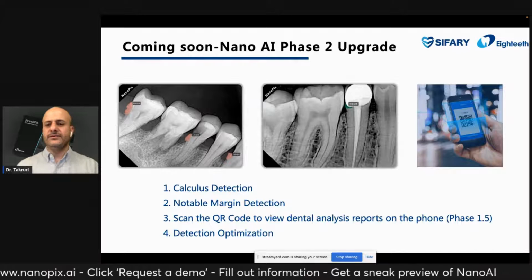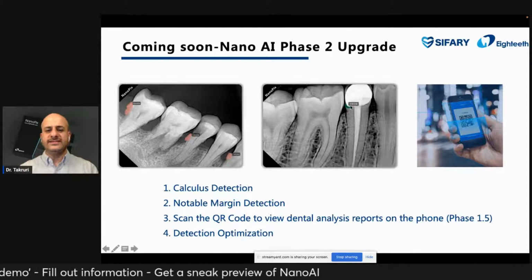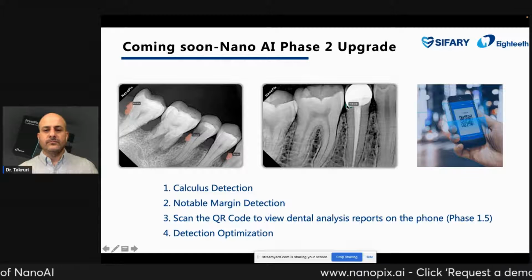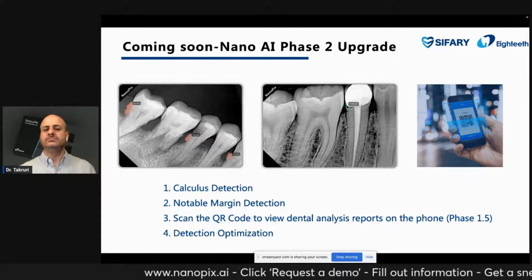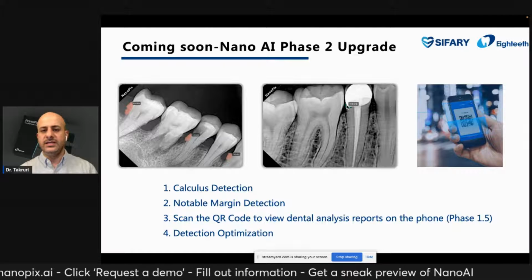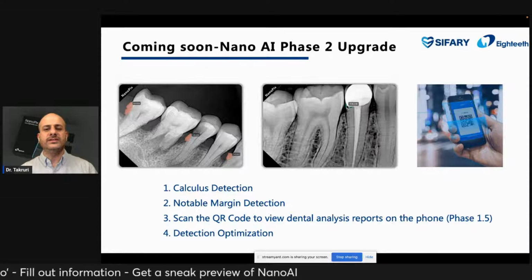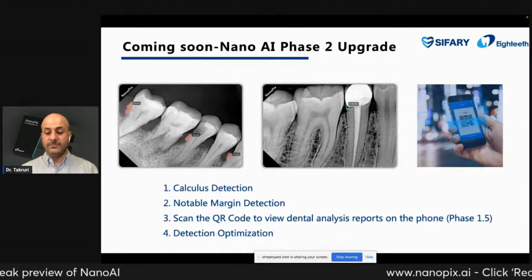Here you can generate a QR code, and your patient can read it. When you have, let's say, an upper margin, like in this case, your patient will see it in colors, and will understand why he or she has to change this crown, or what the main reason for food impaction is, for example.